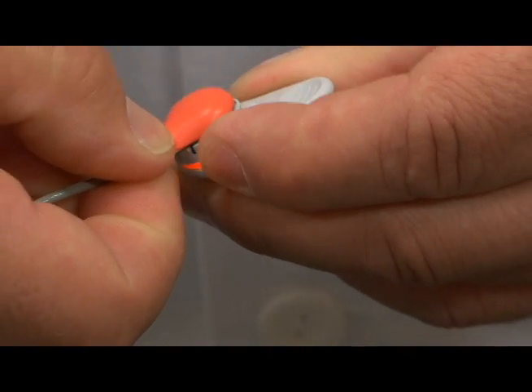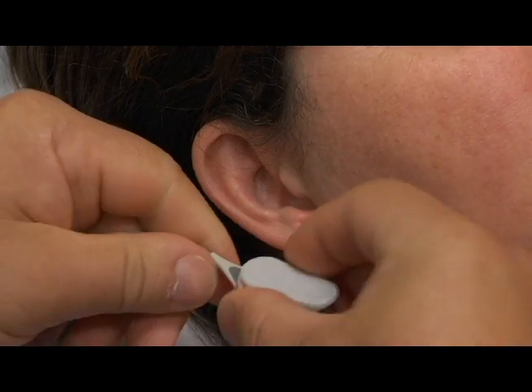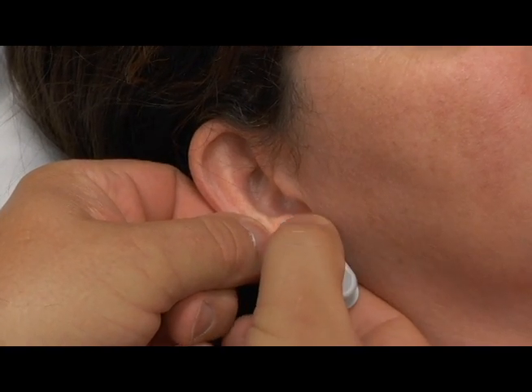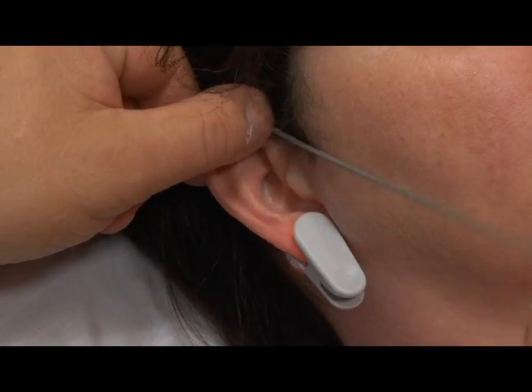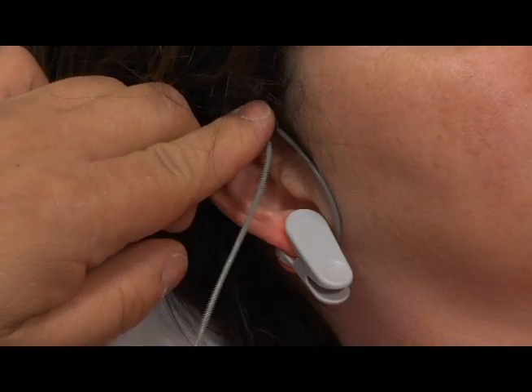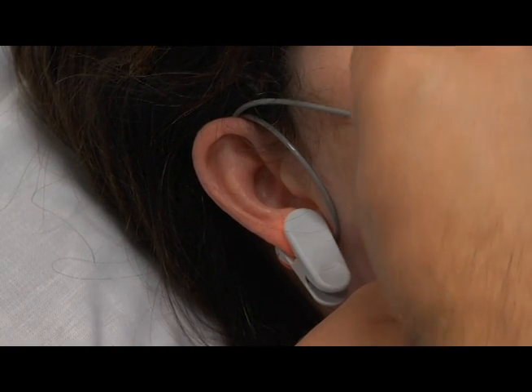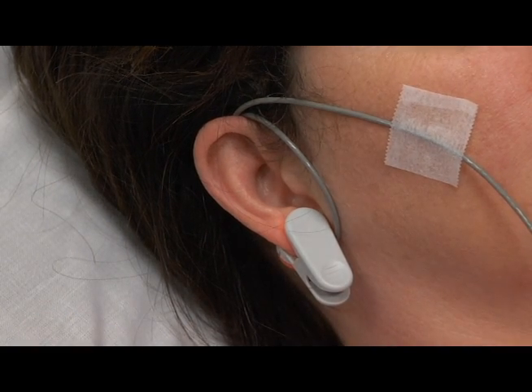Check that the sensor can be easily rotated to assure that it is snapped in correctly. Pull the earlobe in a horizontal position and attach the sensor from below to the back side of the earlobe. Close the clip from above, then guide the earlobe back to vertical position. The sensor is applied correctly if the whole dark surface is covered by the earlobe. Ensure good contact with no air gaps between the membrane and the earlobe. Wrap the sensor cable around the ear once, tape the cable to the cheek, and secure the cable with the clothing clip on the patient's shirt or bed linen.